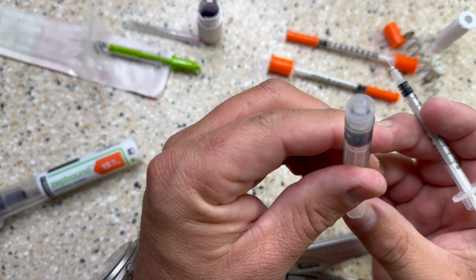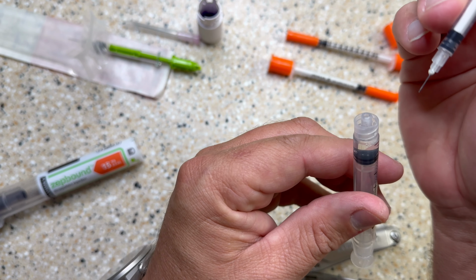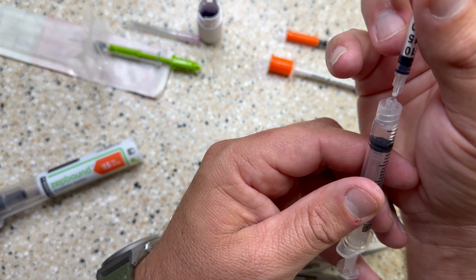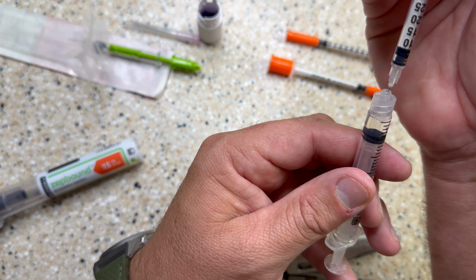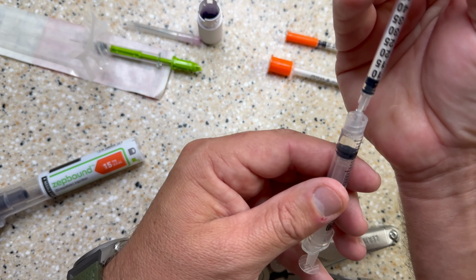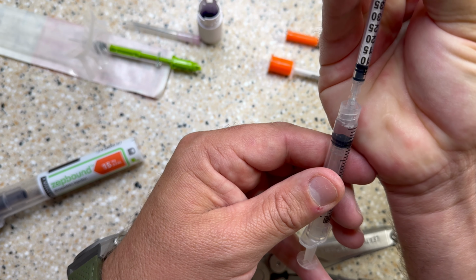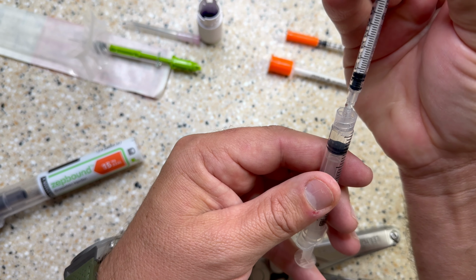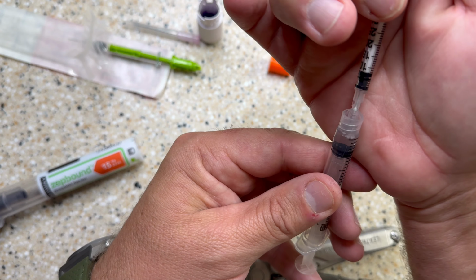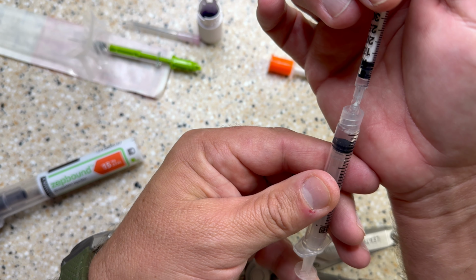I don't know if you can catch that on here very well. I'm trying to zoom in here. And then you insert your needle carefully because this is what you're actually going to inject with. And then with the other hand, I'm going to draw it out. So it's kind of a dance to go drawing here and carefully pushing the product into the neck over on the other side. So getting it started to me is always the hardest part.